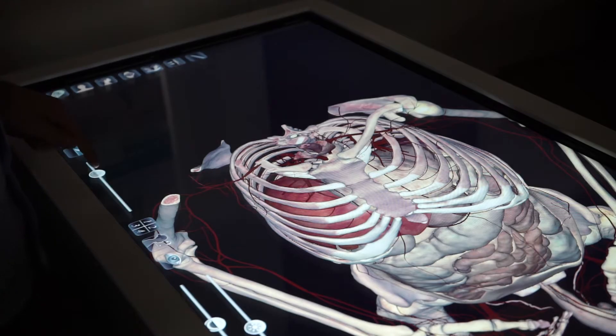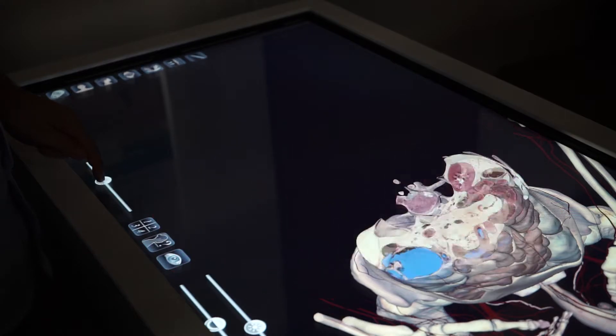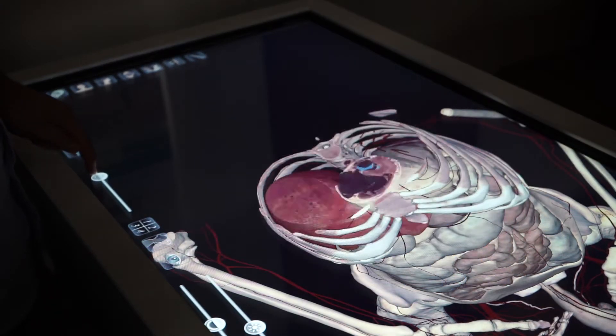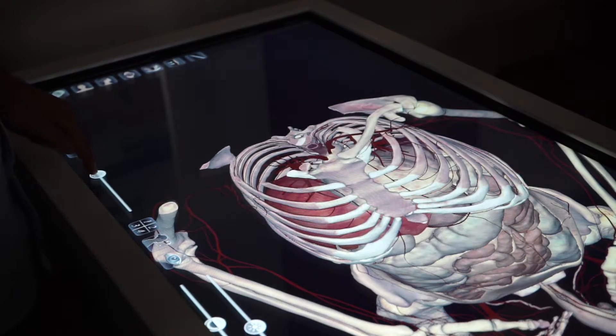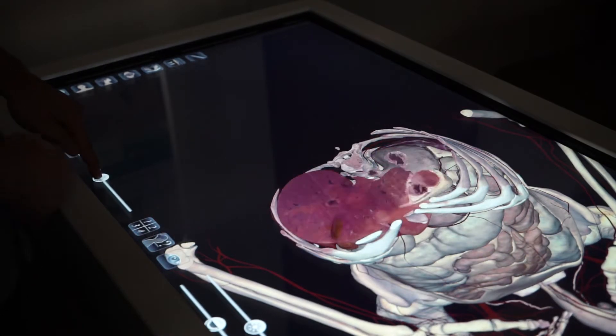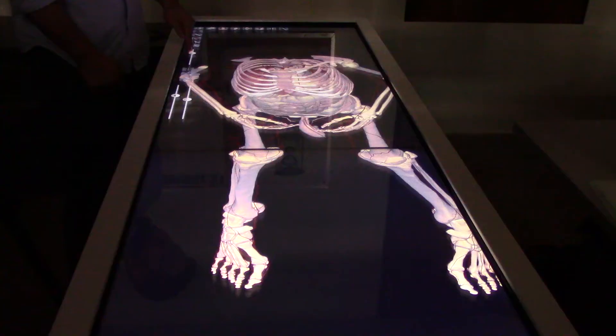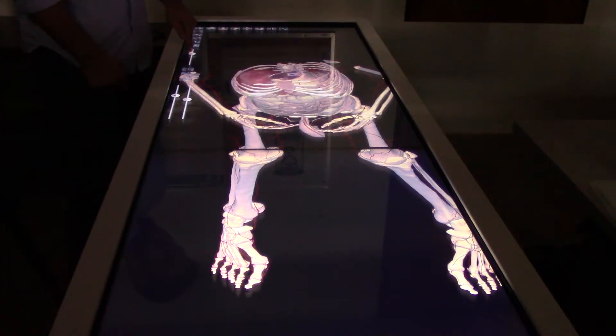I can also move that slice by using the slider on the side, moving the slice up and down from the body at the angle created earlier.